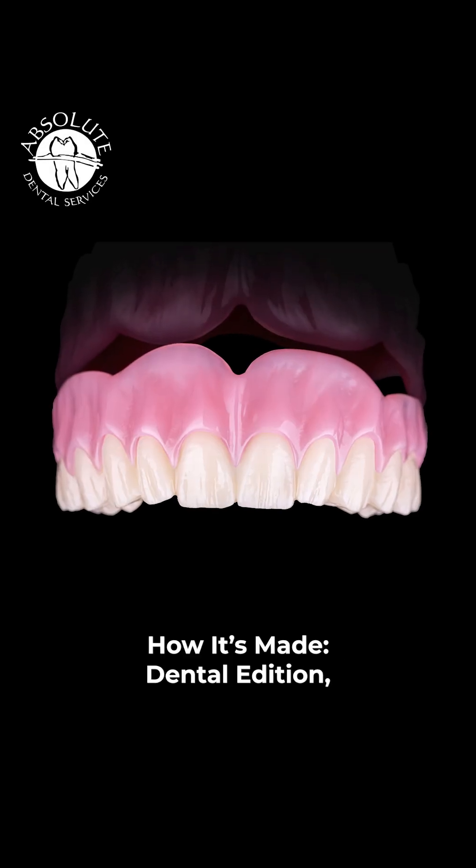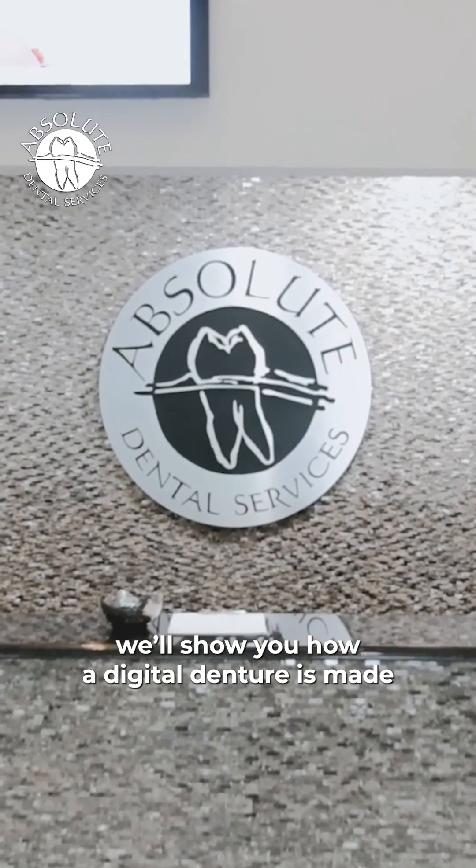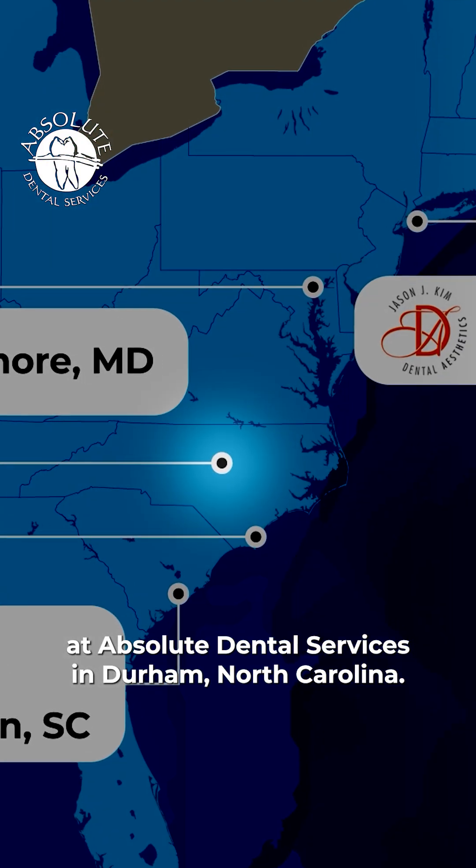In today's episode of How It's Made Dental Edition, we'll show you how a digital denture is made at Absolute Dental Services in Durham, North Carolina.